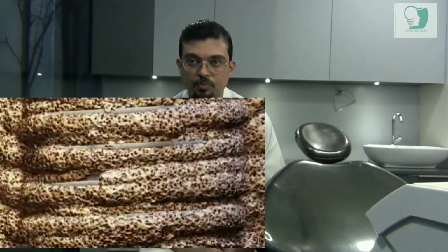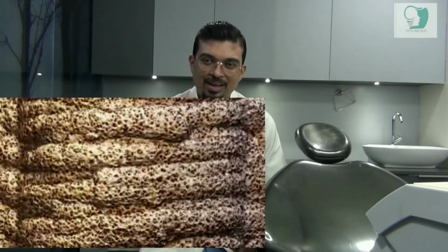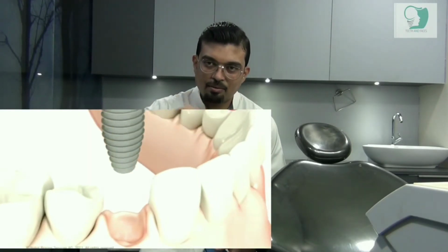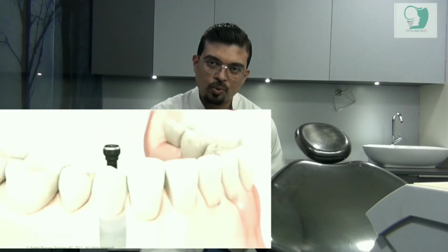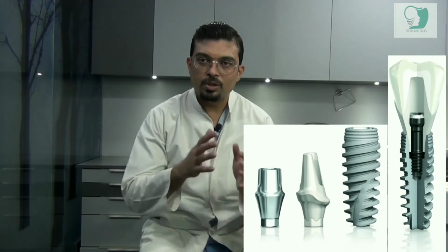inside the bone. So the second component, which is called the abutment, we come back after 3 months, and with the help of another screw, we fix this abutment, with the tooth attached onto it, into the cylinder body, which is hollow from inside.